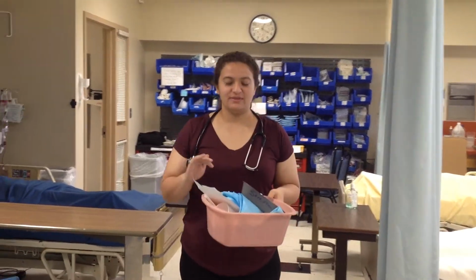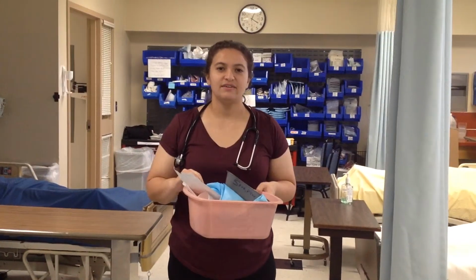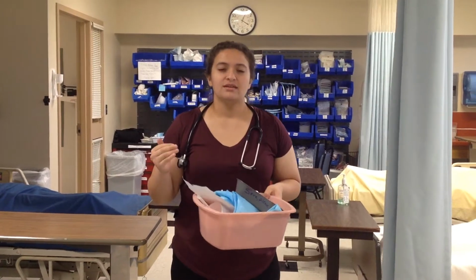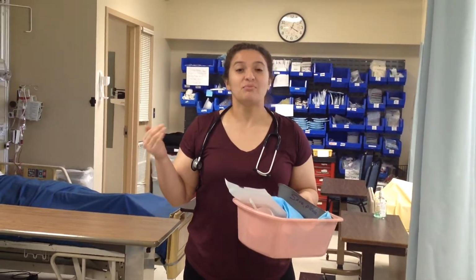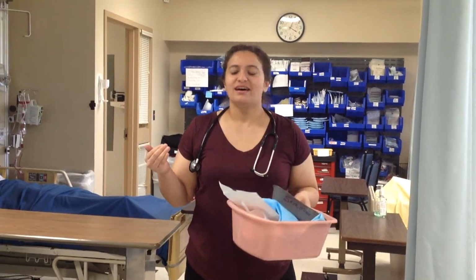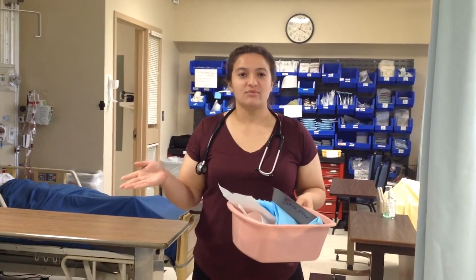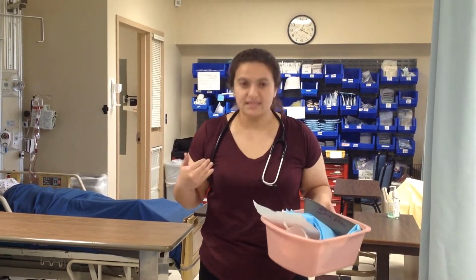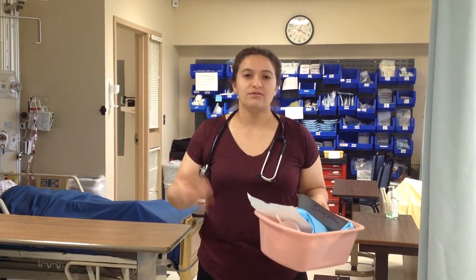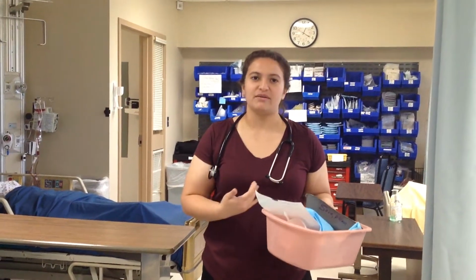So I'm going to be doing the nasogastric video and the suctioning as well. Before doing this procedure, I would make sure to have proper personal protective equipment, depending on the patient's contact precautions. But for now, I'm just going to say that obviously I would be in proper uniform attire, so have scrubs on, and I would also have my name tag to identify myself.